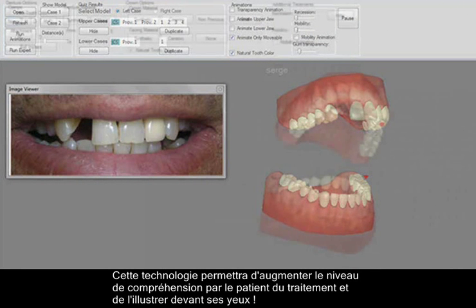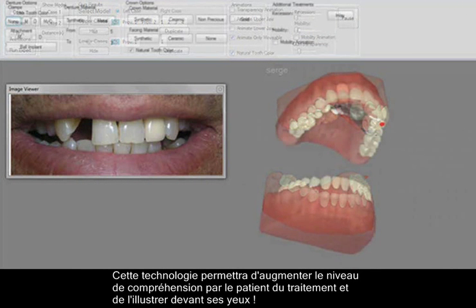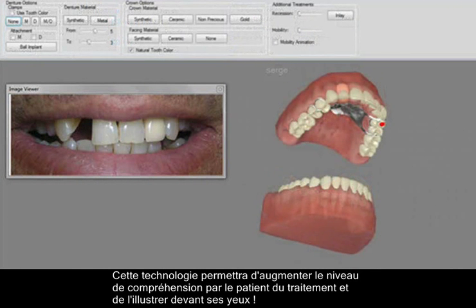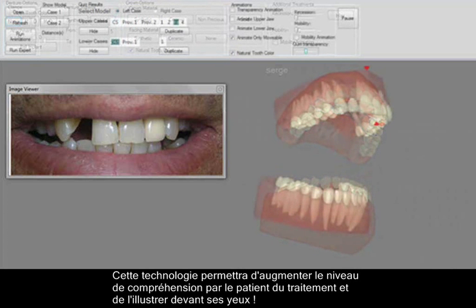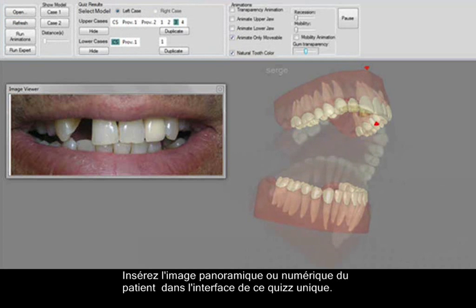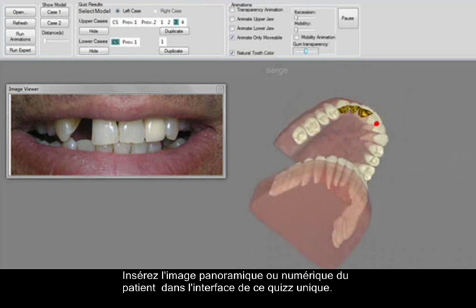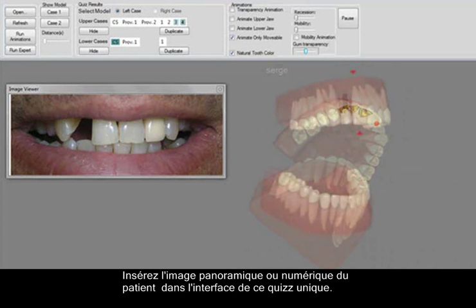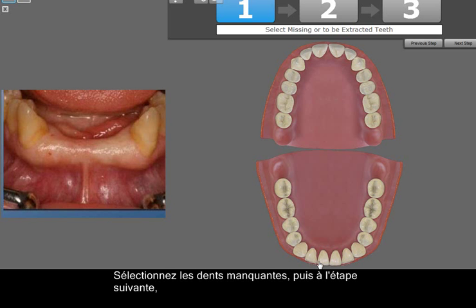This technology will increase the level of understanding by the patient and illustrate the treatment before his or her eyes. Insert your patient's panoramic or digital image in this unique quiz interface, then select the missing teeth.